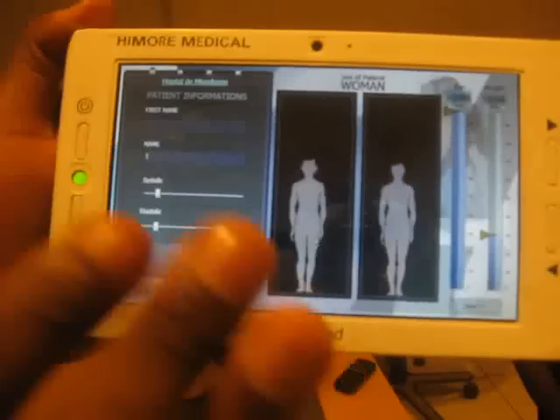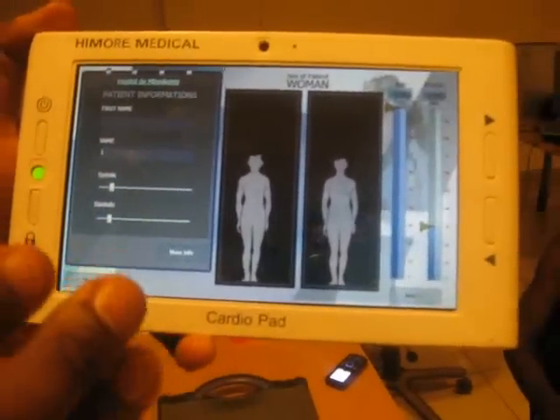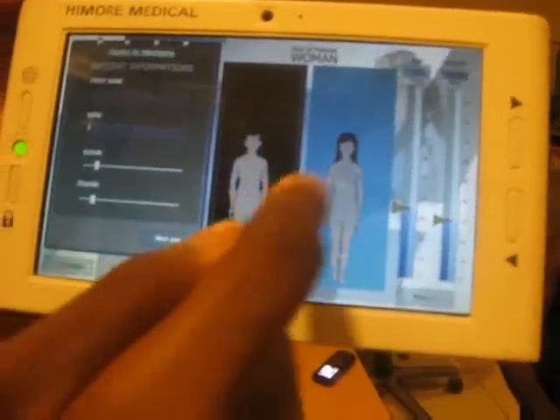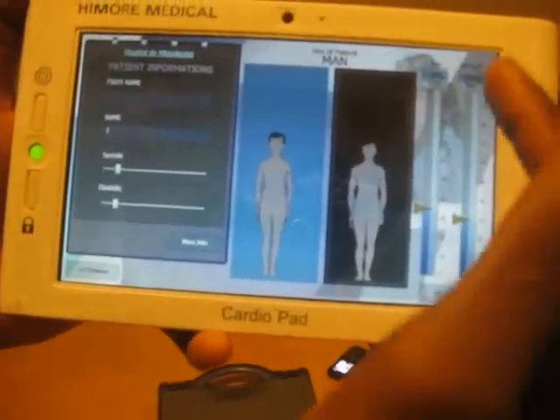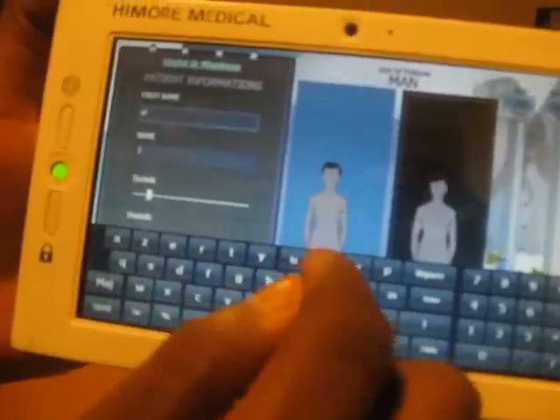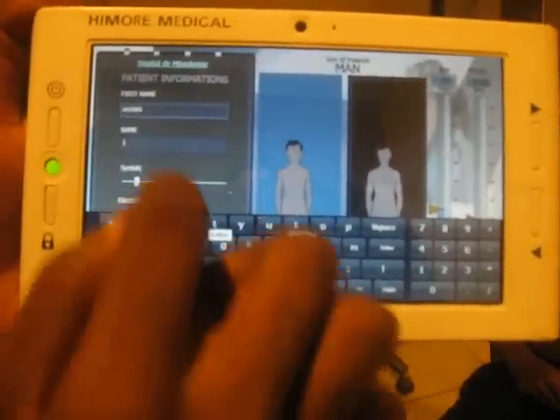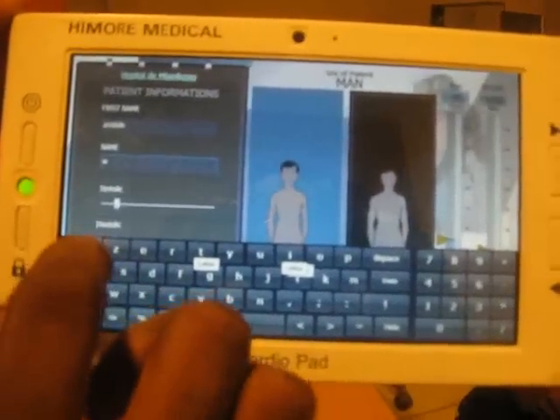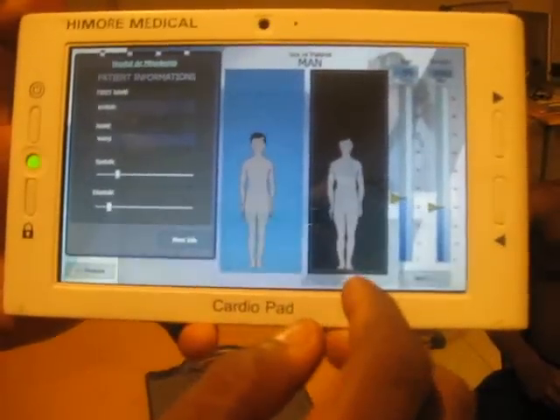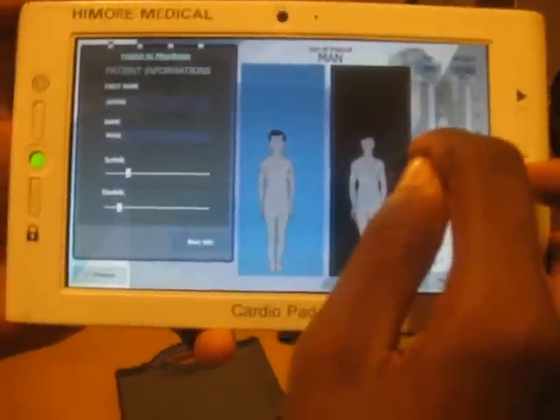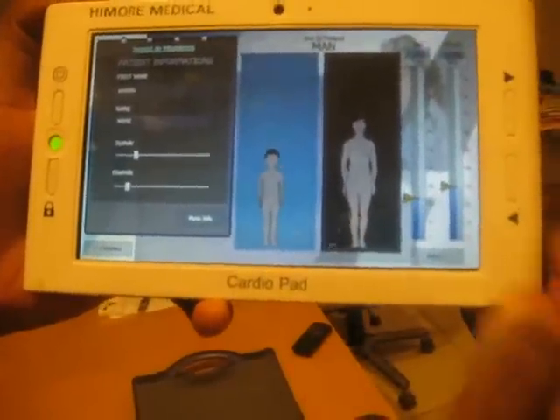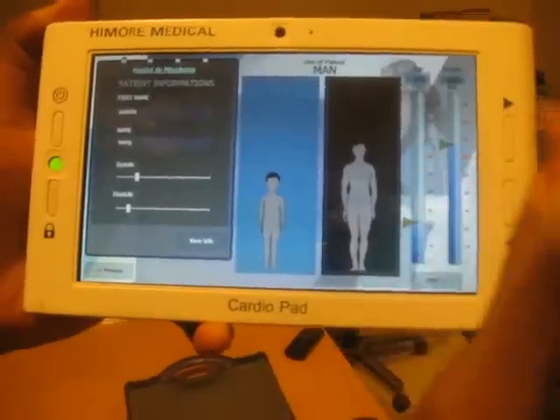In the second step, the nurse will enter the parameters of the patient, which are the following: the name of the patient, the arterial pressure of the patient, the sex of the patient (whether the patient is a woman or a man), the age of the patient, and the weight of the patient. We will enter the name of the patient, the arterial pressure, then give an age — for example, 22 years — and the weight of the patient, for example 68.